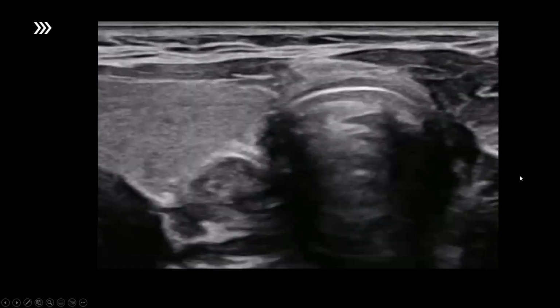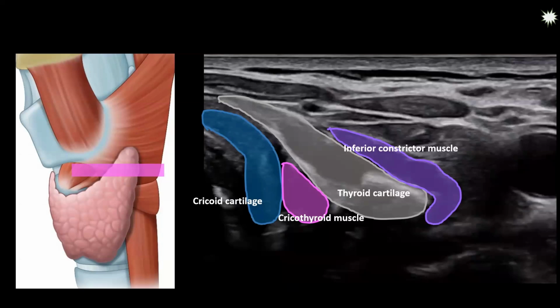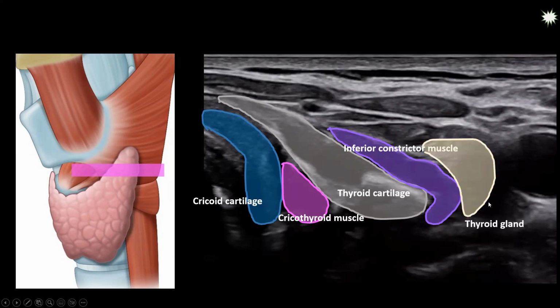This patient happened to show the esophagus on the right. The thyroid gland is positioned in front of all these structures, and if you repeat them again in the cross-section, you see the cricoid cartilage, the cricothyroid muscle, the thyroid cartilage, the inferior constrictor muscle, and the outermost thyroid tissue.